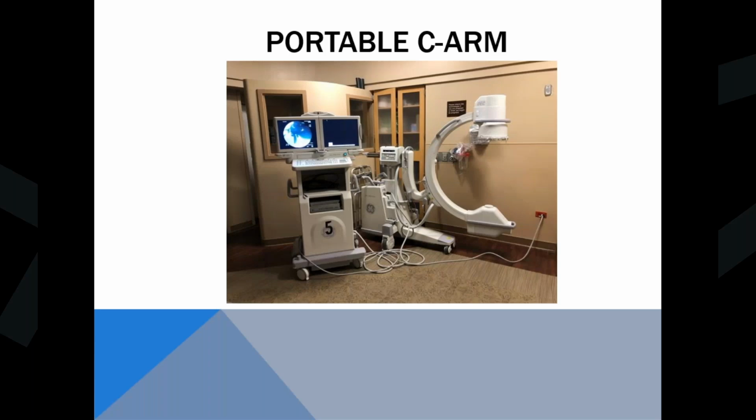They can start the arm at this position and move it all the way to its complete end, and have the full thing so that the surgeon can go back and say, oh, we got a hang up here, or everything looks good, we got a full range of motion, so we're done and can move on. So there's a number of different modes this can be used in.